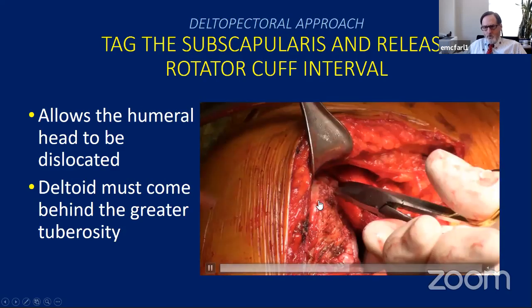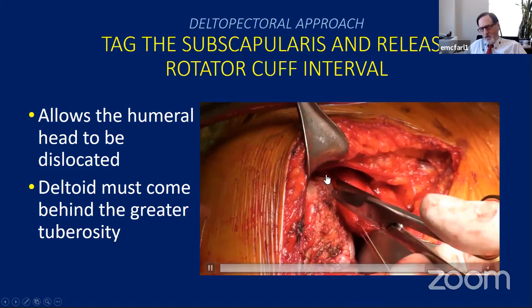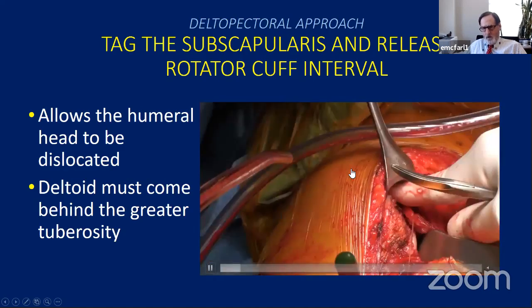But you want to make sure that you release all the adhesions in the subacromial space if you can. It's a little harder in patients who've had previous rotator cuff repairs. So you have to be real careful how you handle the deltoid.